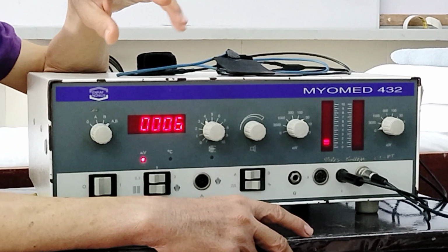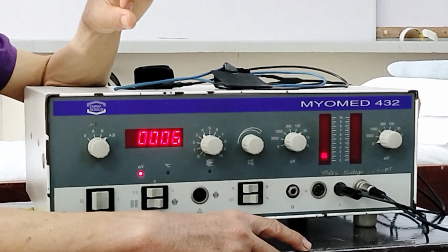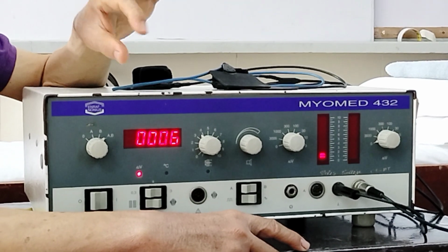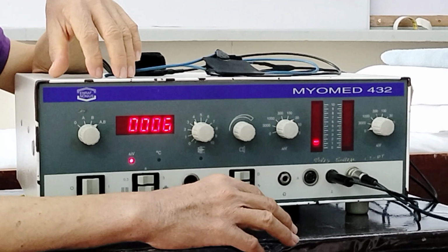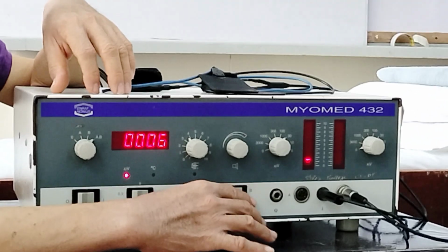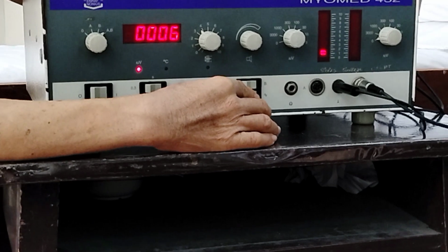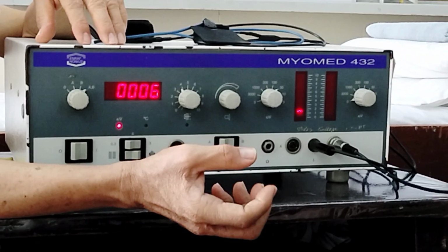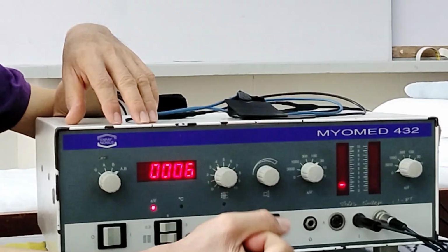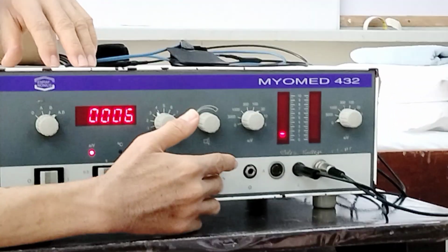The rectified signal sounds like tak tak tak tak. Usually with the auditory signal, you tell your patient, sir, I want you to contract the muscle or bend your wrist, and then you can hear a certain sound.